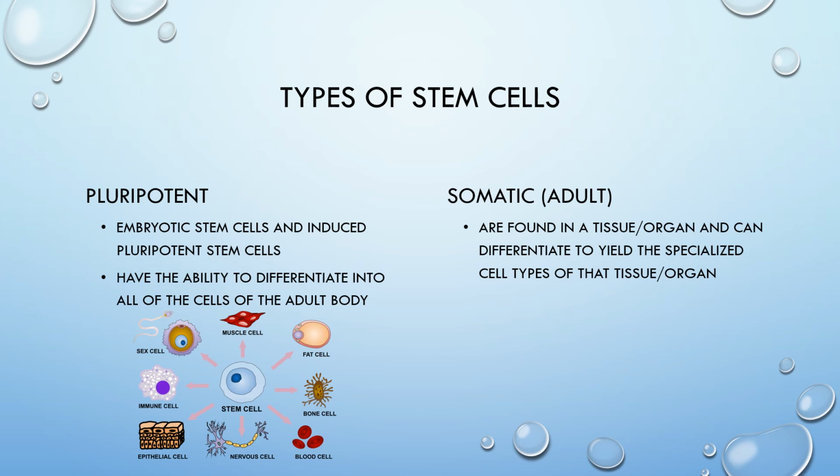For example, human-induced pluripotent stem cells and human embryonic stem cells must be cultured on coated plates with a supporting layer of feeder cells such as mouse embryonic fibroblasts or human foreskin fibroblasts, or on an extracellular matrix such as a basement membrane gel.